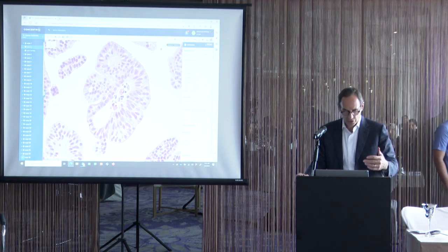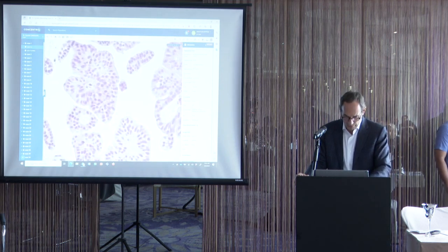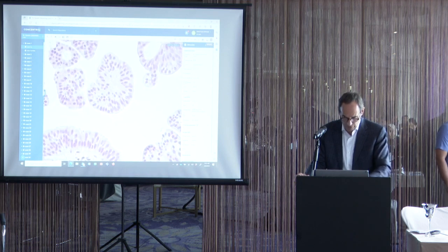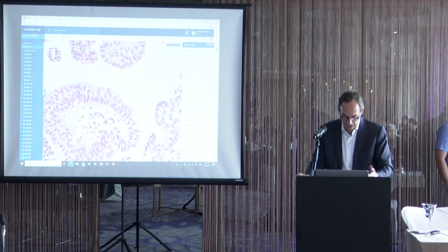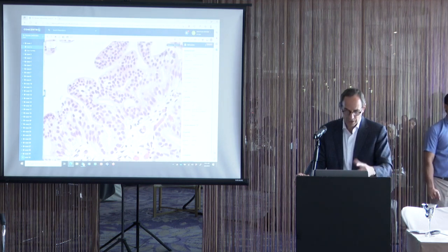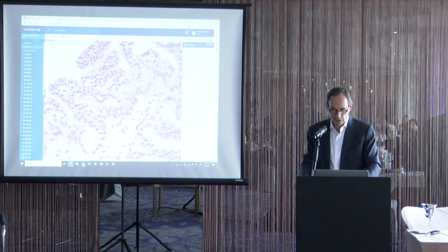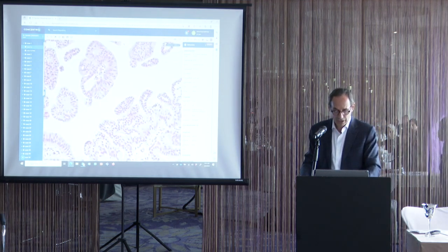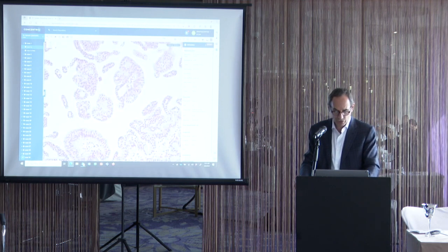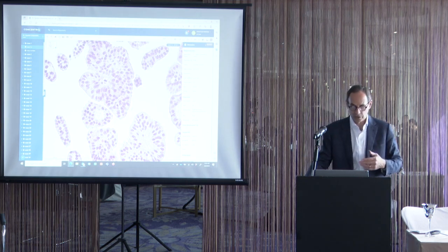Prostatic ductal adenocarcinoma can have a range of cytologic atypia. Here we can see some having prominent nucleoli, but if we move it around a little bit, some of these look more like the nucleoli are not as prominent. And that can be a problem. Sometimes some pathologists are not comfortable calling prostatic ductal adenocarcinoma when there are less prominent cytologic features. But architecturally, when you see these papillary structures lined by pseudostratified columnar epithelium, there's nothing else that this can be. This is prostatic ductal adenocarcinoma.